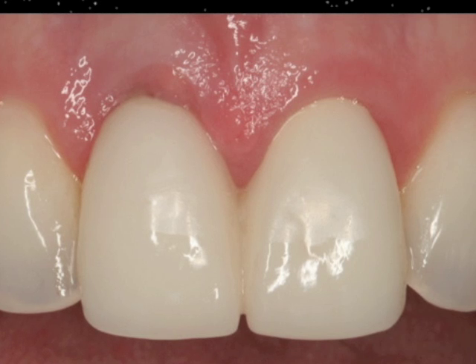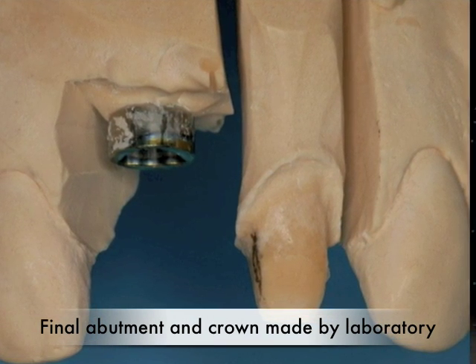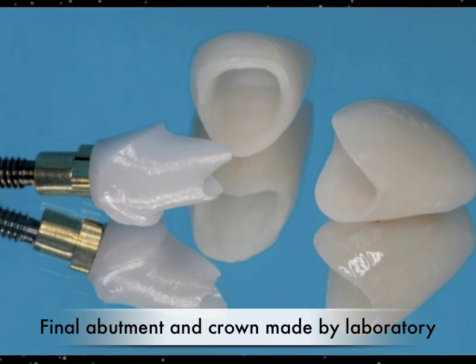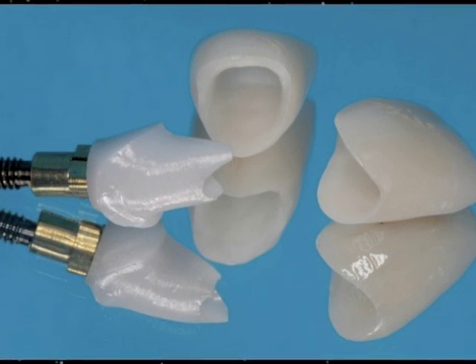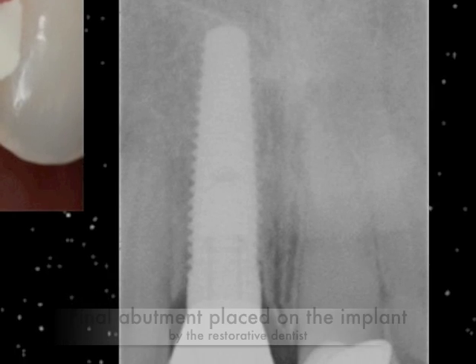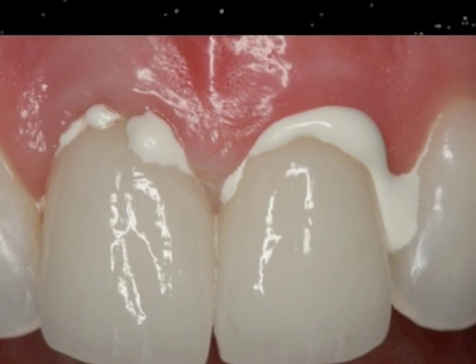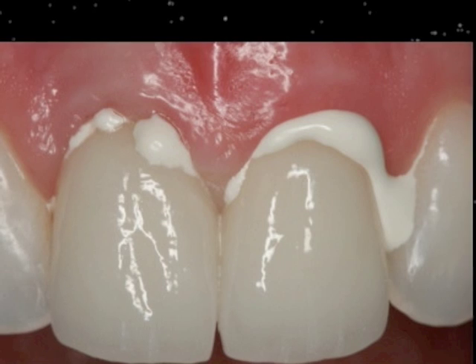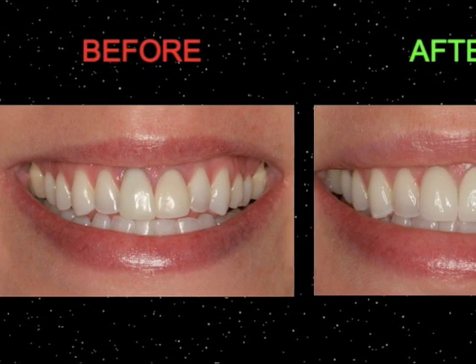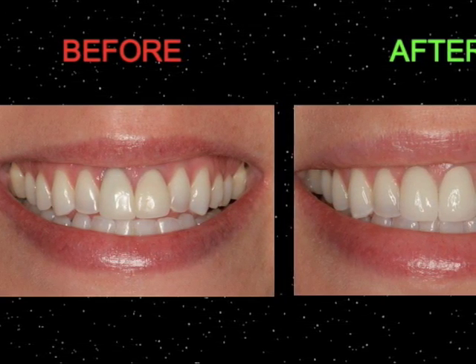Before the final crowns are made, many people will bleach their teeth and lighten them. We then go through a series of technical measurements and impressions to make the laboratory components for the crown and the implant. When we receive them back from the laboratory, we can painlessly — now without anesthesia because there are no nerves — place the abutment on the implant, then the crown on top, using the right combination of cements to cement both crowns so they look identical with the same gingival contours and aesthetic look.